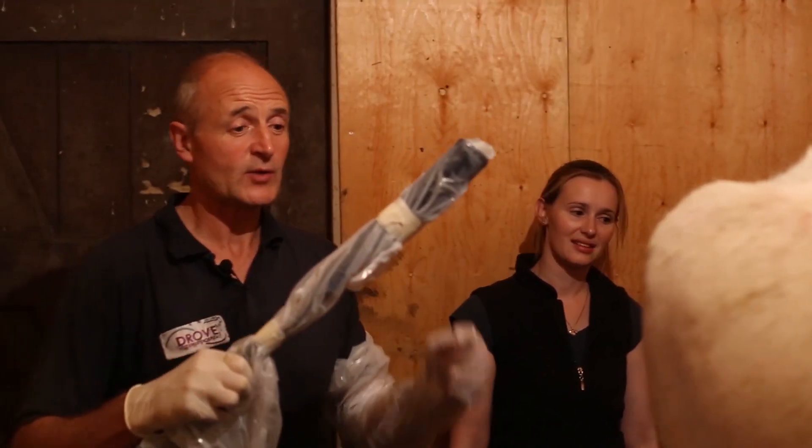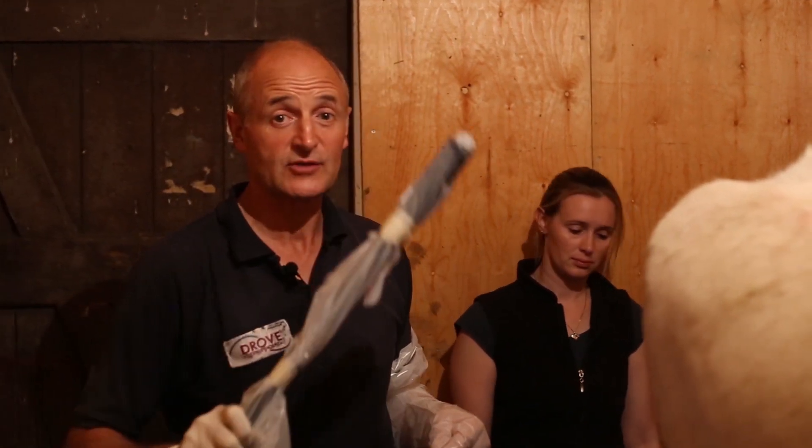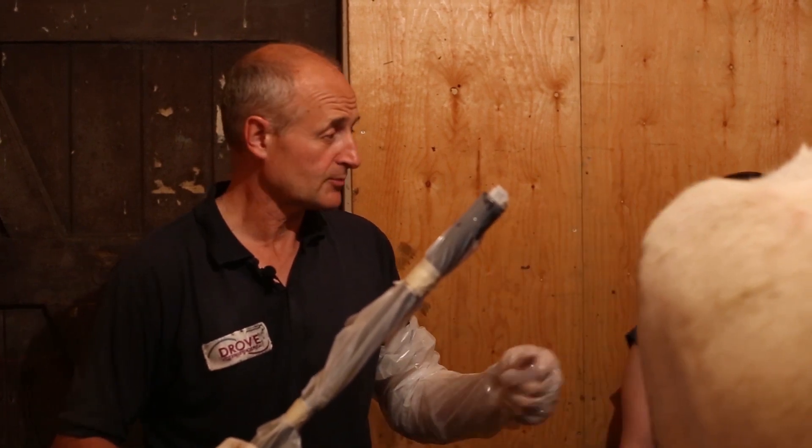The ultrasound probe is always gloved up freshly for each cow, so we keep it very, very clean and there's no danger of transmitting anything from one cow to the other as we go through the morning.